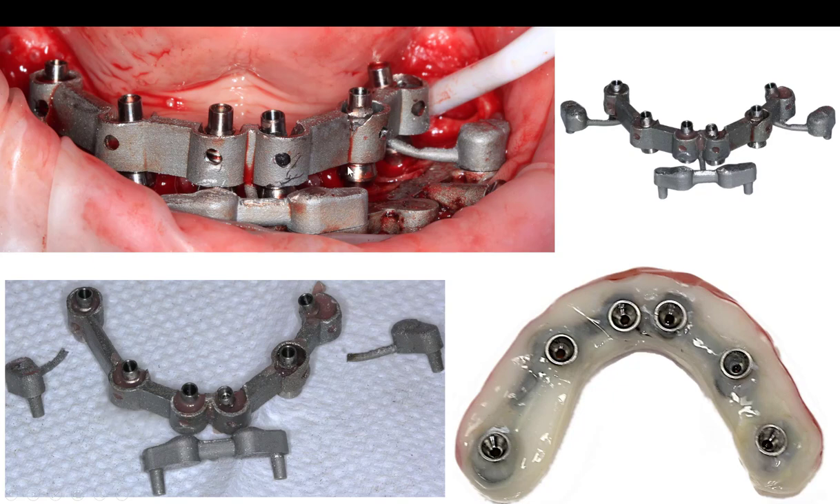If you look closely, you can see this cylinder is not coming through the center of this hole where it should have been. And what I found was that adjusting on this metal took a lot of time and effort. This is chrome cobalt so it's incredibly hard and it's very difficult to stretch a hole should you need to. So I wanted to come up with a better method for that. Typically we would pick this bar up and then take it out of the mouth and section off the little magnetic components that index it, then bond the bar into the pre-made temp. But I still felt like it could be improved and made more efficient.